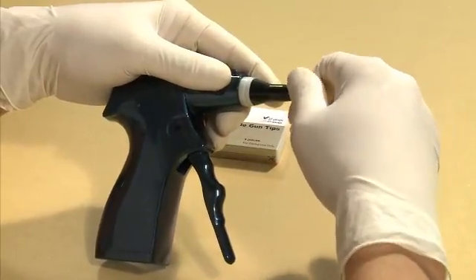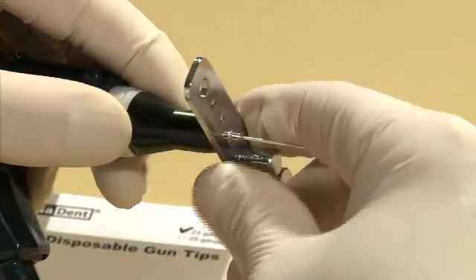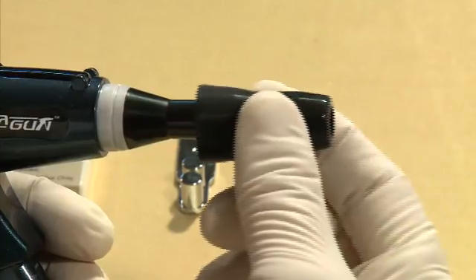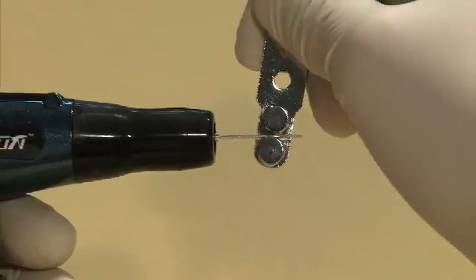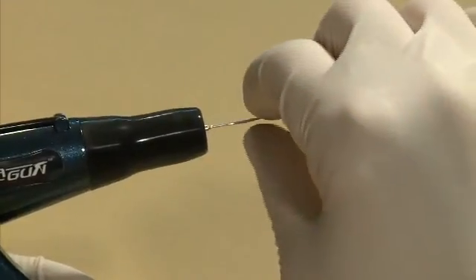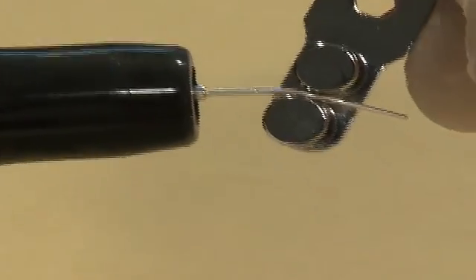Insert the gun tip into the handpiece and use the multi-purpose wrench to securely tighten it into place. Place the safety cap on top of the heat chamber to prevent possible injuries and burns. Use the multi-purpose wrench to bend the tip to the desired shape and angle — bending the gun tip by hand will result in damage to the tip, therefore the multi-purpose wrench must be used.